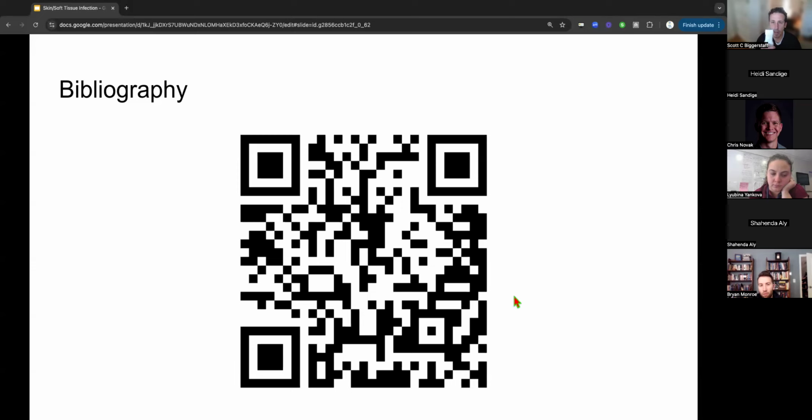We're using our vascular probe, linear array. It's the one that's boxed off at the top. That's because we want something that's high frequency, that's going to give us really good resolution, point-to-point differentiation in that image. So you can use an abdominal probe in a patient that's obese, but generally the vascular probe or the linear array is going to be your go-to. This typically is going to be able to scan down to about 6 or 8 centimeters. So if the area of concern is any deeper than that, you'll have to switch probes.